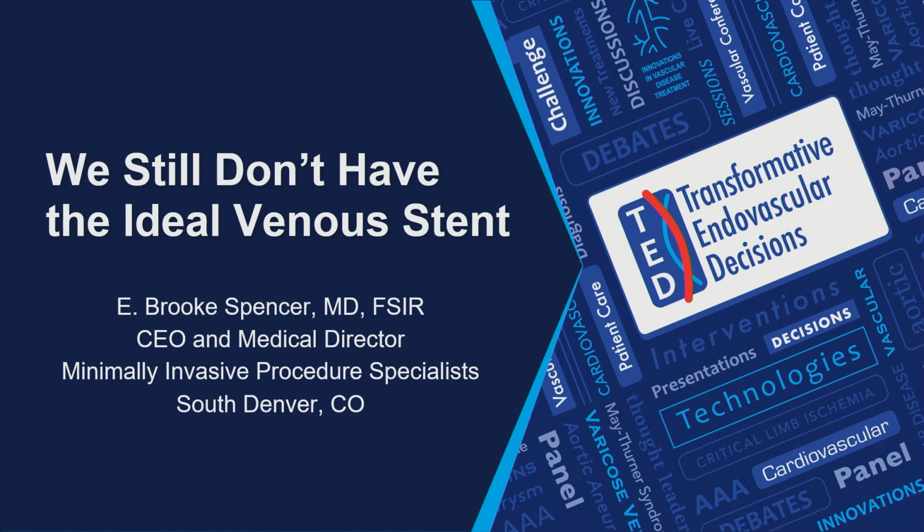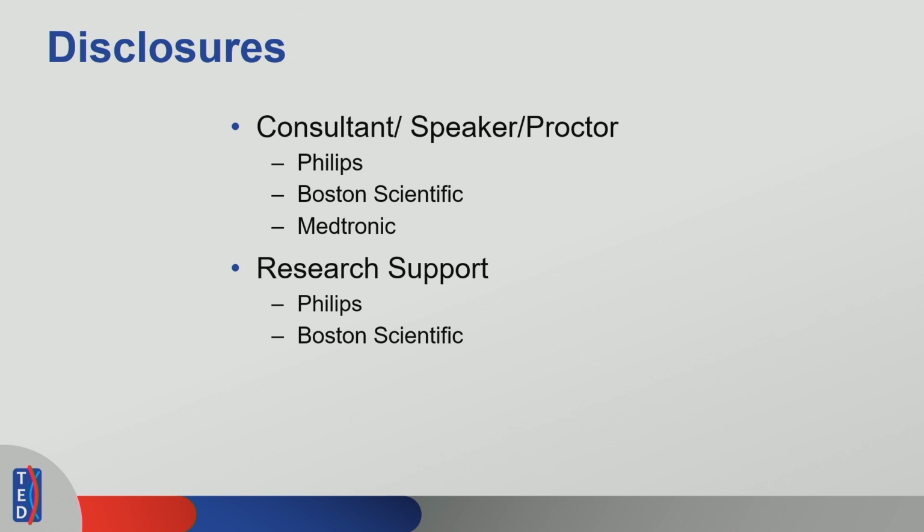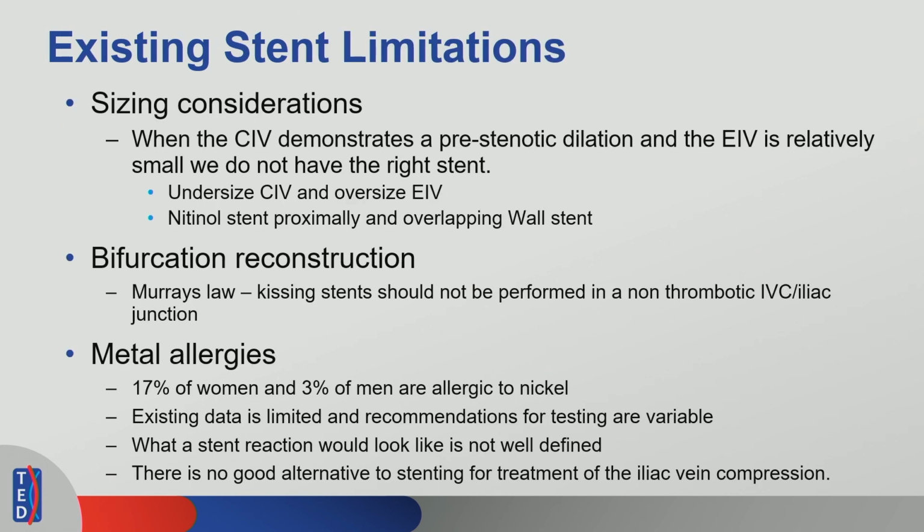All right, I got given, we still don't have the ideal venous stent. These are my disclosures. If I'm on this side of the argument, then a couple of the issues that I see with our current stents is that sizing considerations can be really tricky. When the common iliac vein demonstrates a pre-stenotic dilation and the external is relatively small, it's really tricky to figure out how to size those stents or place them without migration or disrupting flow dynamics. Reconstruction of the bifurcation is still a thing that we don't have the right stent combination for, and understanding Murray's law is really important in that. We'll talk about that. And then finally, metal allergic patients are actually more common than one would think, 17% of women and 3% of men.